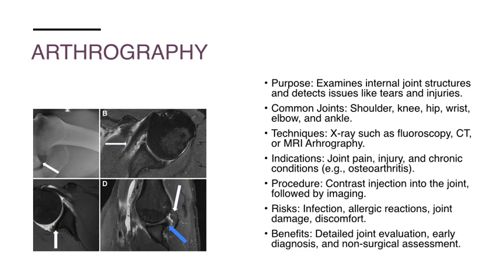Osteoarthritis. Procedure: contrast injection into the joint, followed by imaging. Risks: infection, allergic reactions, joint damage, discomfort. Benefits: detailed joint evaluation, early diagnosis, and non-surgical assessment.